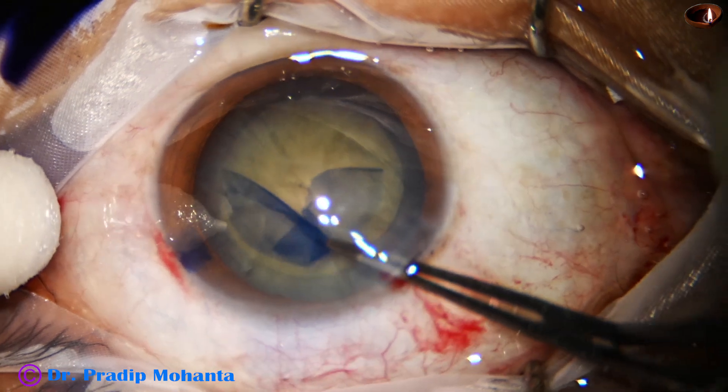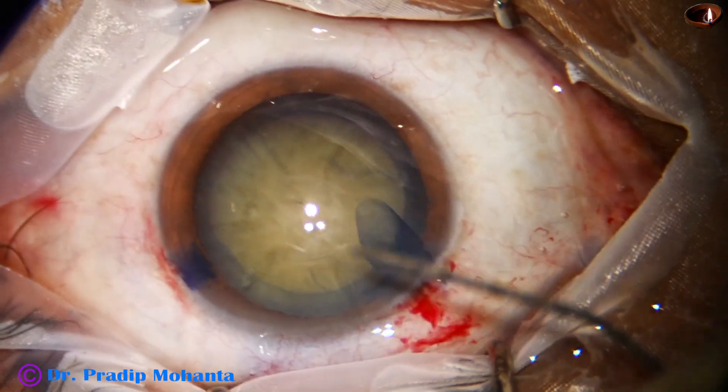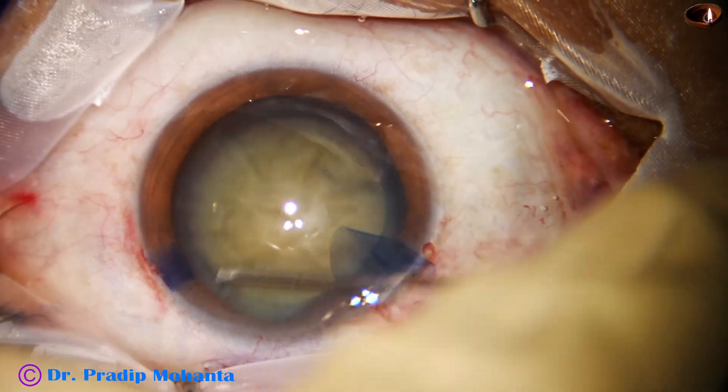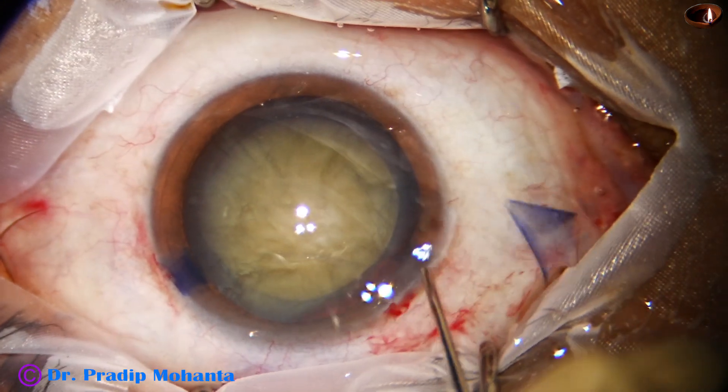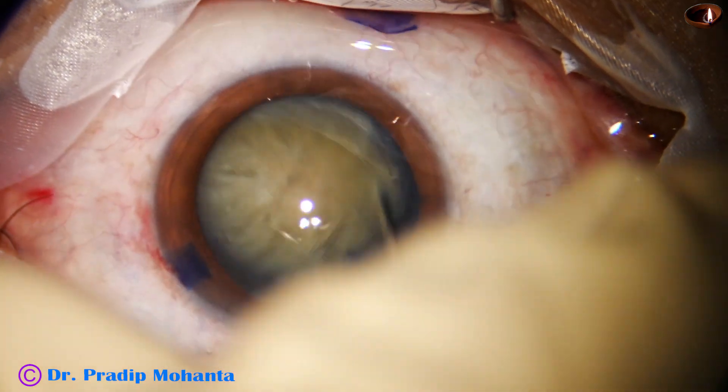I usually rotate anti-clockwise, but it is the surgeon's comfort and surgeon's choice. Anyone can rotate clockwise and do their capsulotomy.